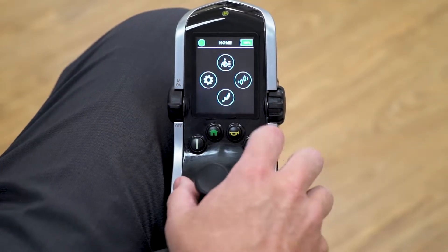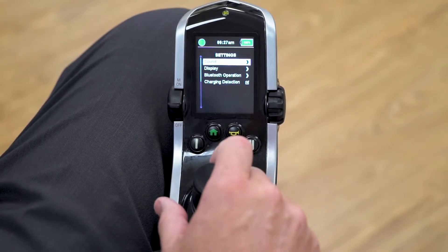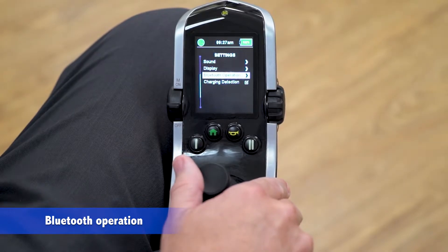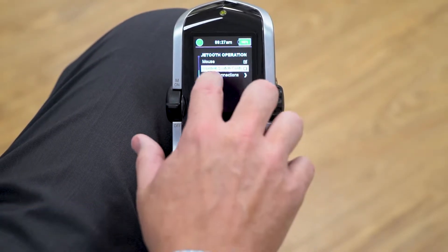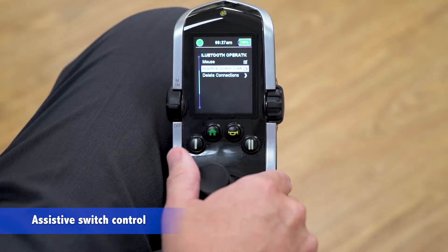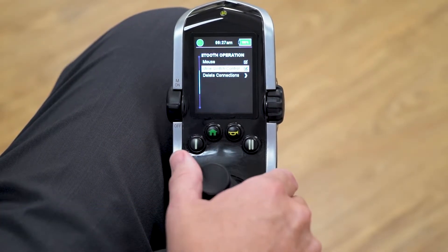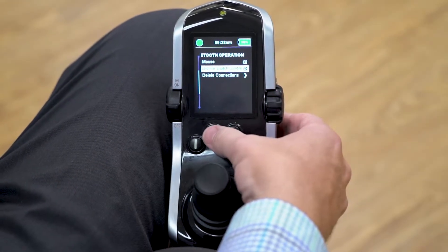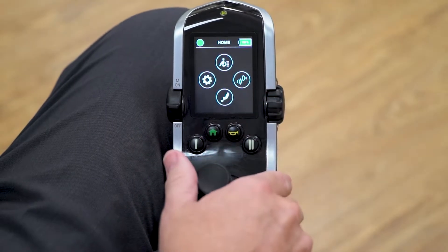The first thing we need to do is go into our settings menu. It's a left command from the home screen, go down to Bluetooth operation, make a right command, and choose assistive switch control. Highlight it and make a right command on your input device. Assistive switch control is now an active option in the Q-Logic 3 system when you go to the Bluetooth menu.